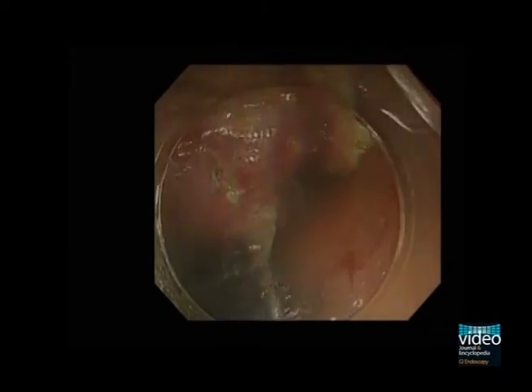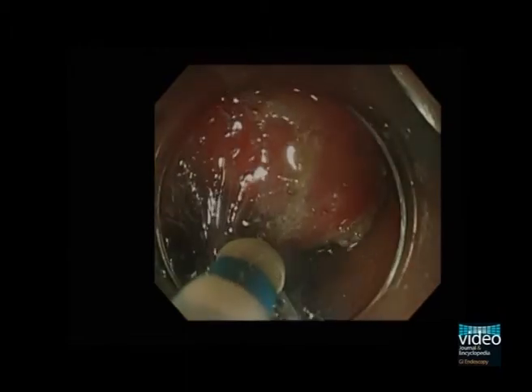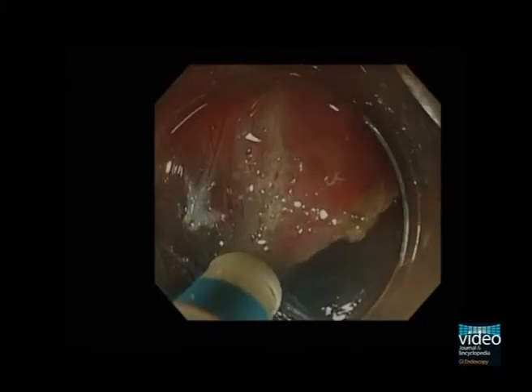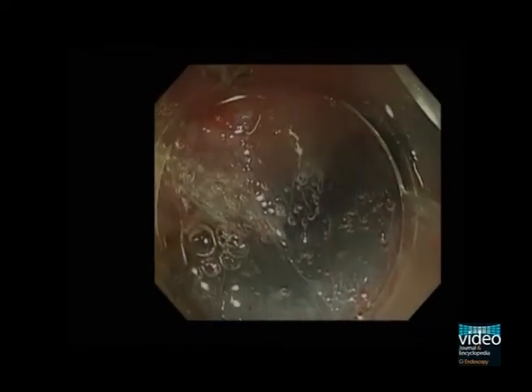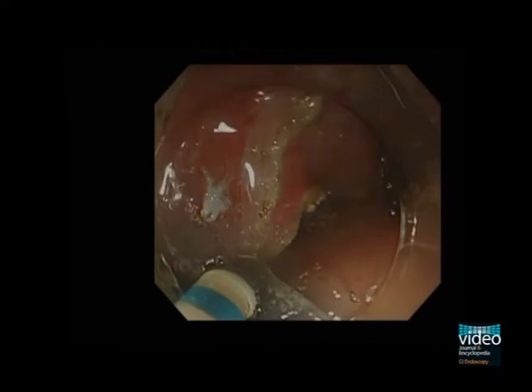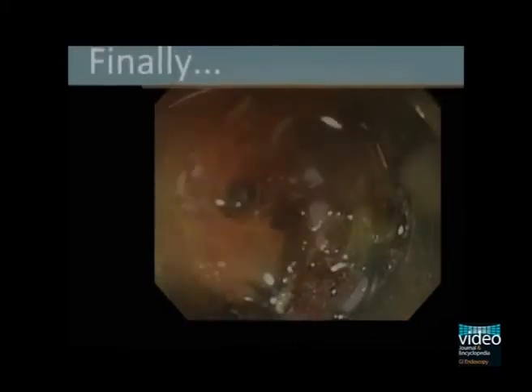We sometimes encounter visible vessels during dissection. Although bleeding complication is rare in the esophagus, we treat visible vessels by haemostat forceps in advance because bleeding can disturb endoscopic view. Finally, we achieved an en-bloc resection of the lesion. The operation time was 60 minutes. This patient was discharged without any complications on day 6 after ESD.